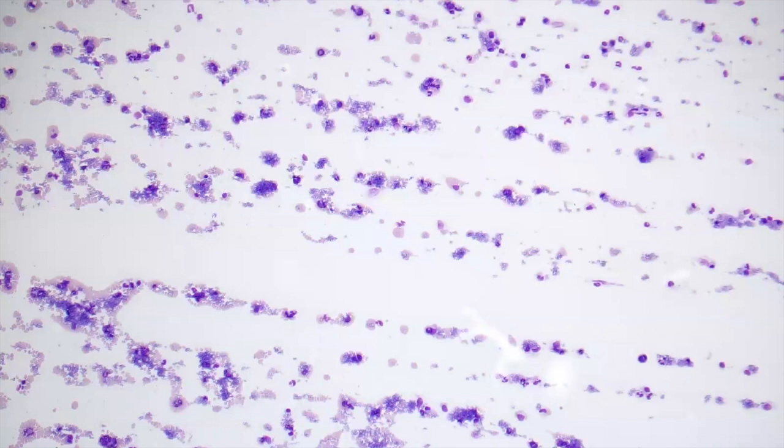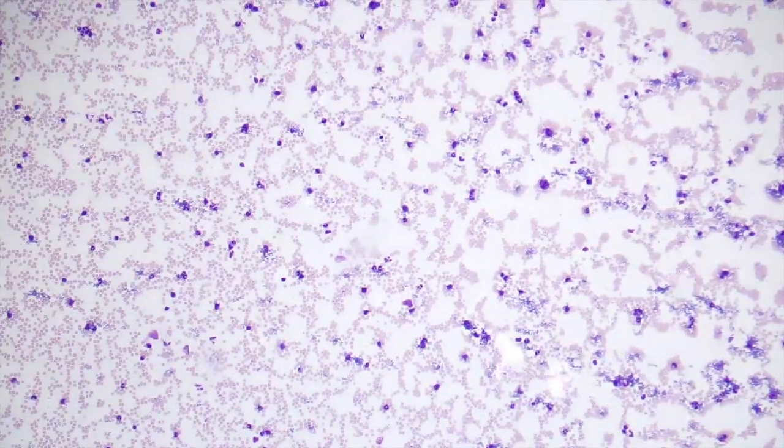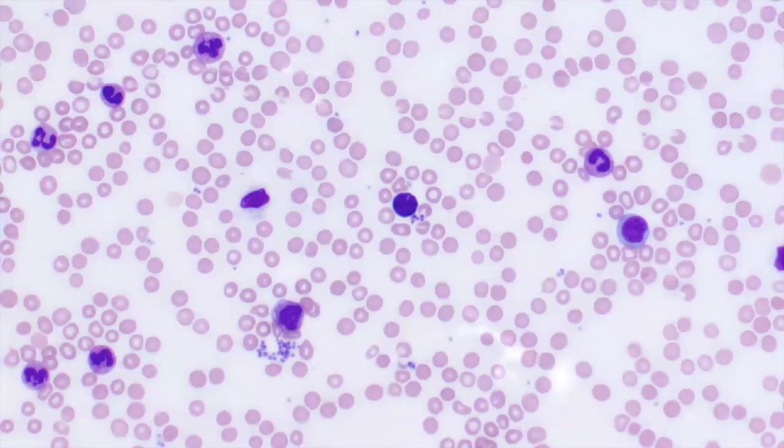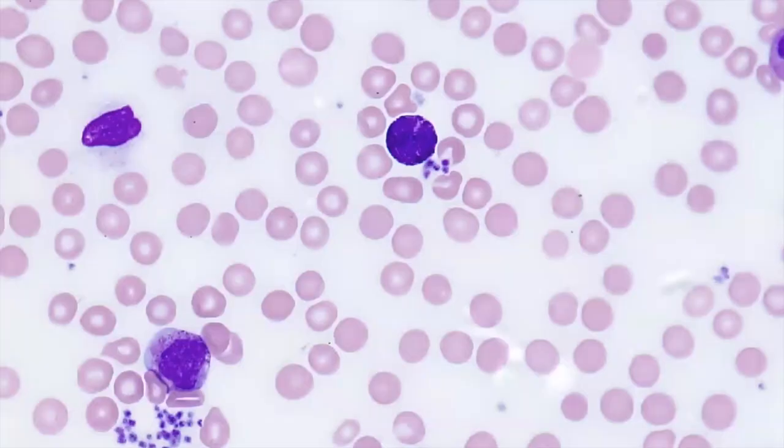Here's another classic disease. Out here on the feathered edge, the most noticeable thing is platelet clumping, which may or may not have caused this patient to have a spurious platelet count result. As we go into the zone of morphology, we first note that there is a prominent granulocyte population with a definitive left shift, and as we move around, we see that there are numerous basophils.